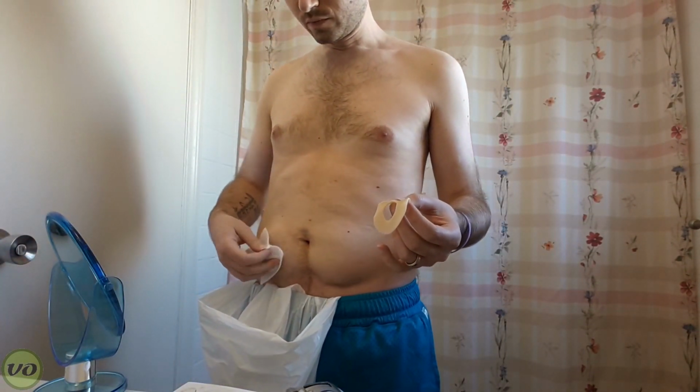Now I'm just going to use a secondary mirror here just so I can see what I'm doing. But you do want to get right up underneath, and make sure there are no gaps whatsoever.